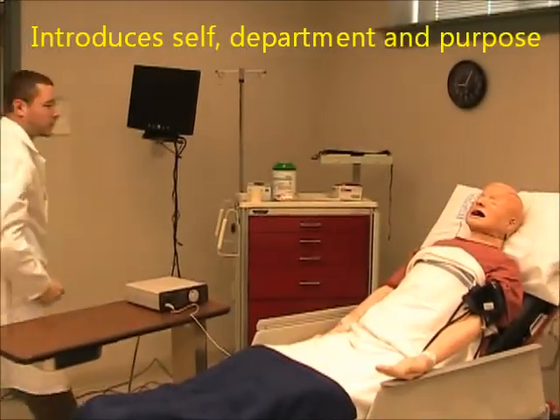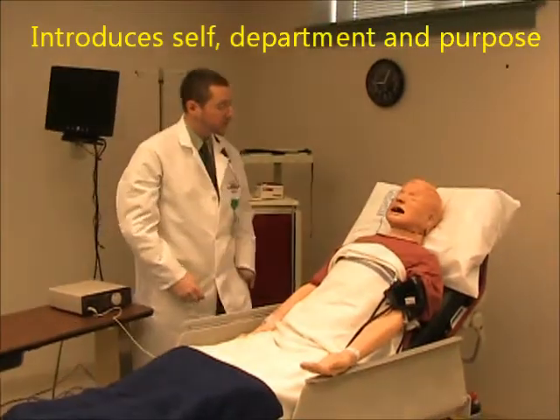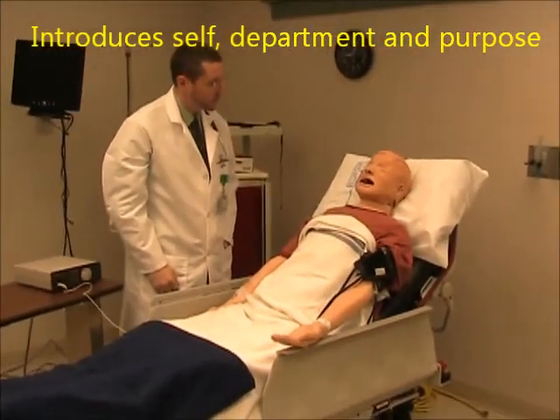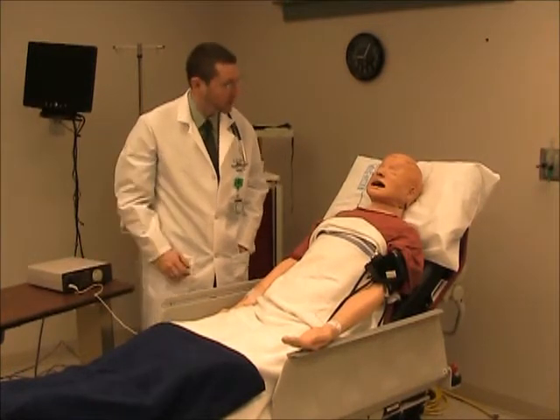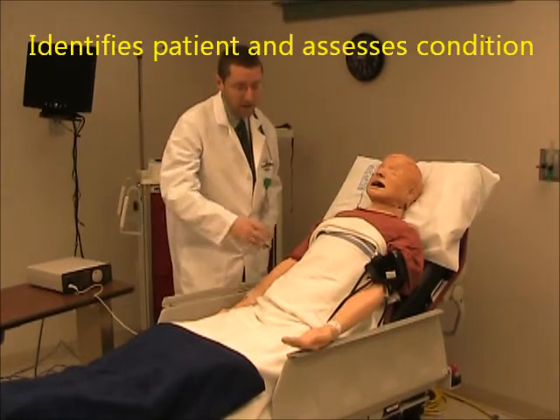Good morning Mr. Sim, my name is Jim from the Respiratory Care Department. I'm here to set up some Oxygen for you. As your doctor has prescribed, your Oxygen level is just a little bit low, so we're going to try and increase that for you this morning.